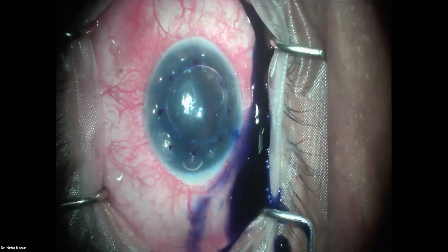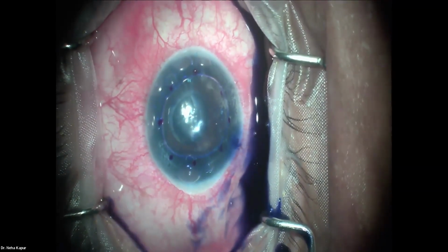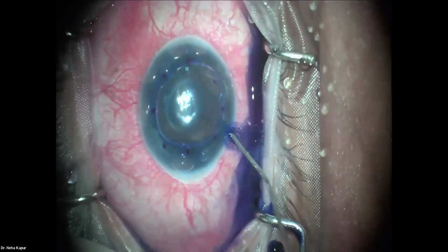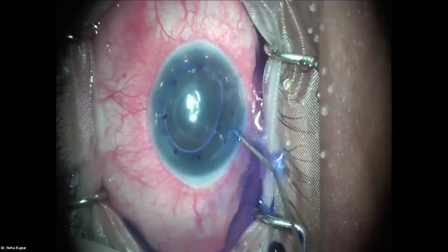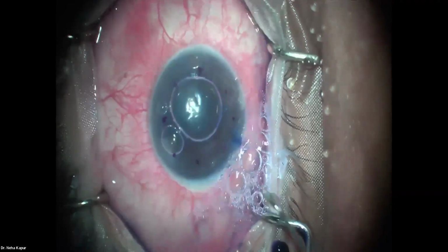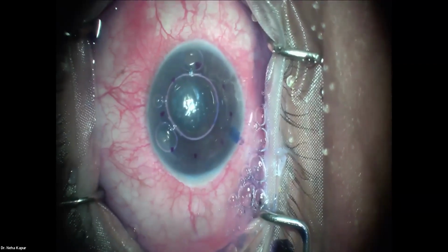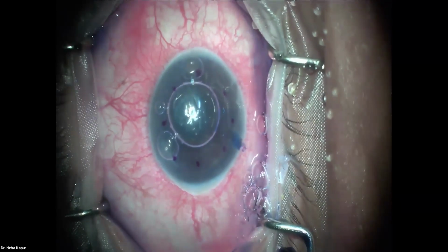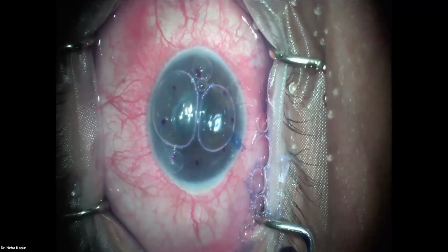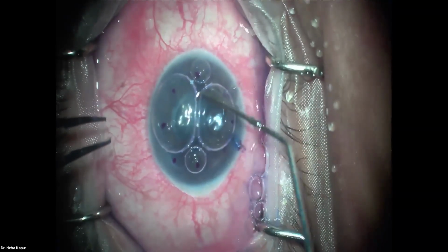So we put a little trypan blue in the eye. That'll help in delineating the Descemet very clearly in the eye. Wash off the trypan blue, and put in air. And if you can see, this is what a Descemet scorer looks like.